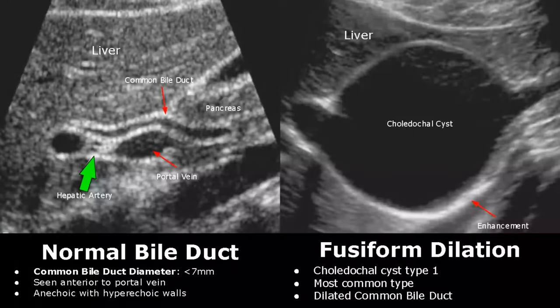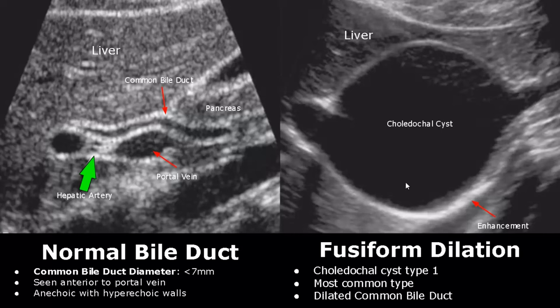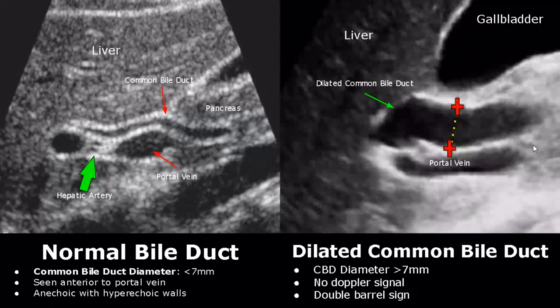Choledochal cysts are congenital dilatations of bile ducts. The most common type is fusiform dilation — it is a type 1 choledochal cyst. The common bile duct is dilated and it is open from both sides; one end leads to the pancreas. Here we have an image of a dilated common bile duct — the diameter will exceed 7 millimeters and there will be no blood flow seen on Doppler.